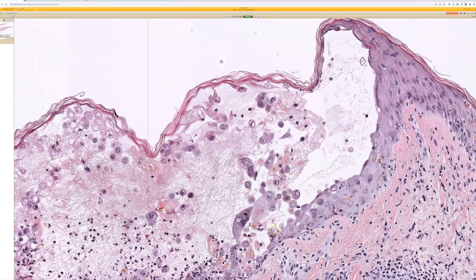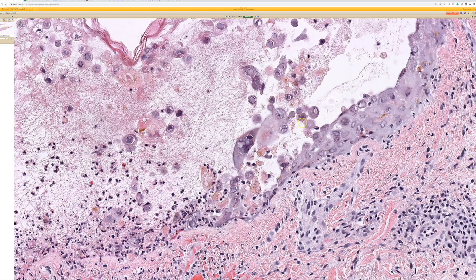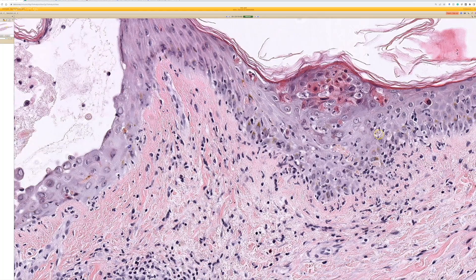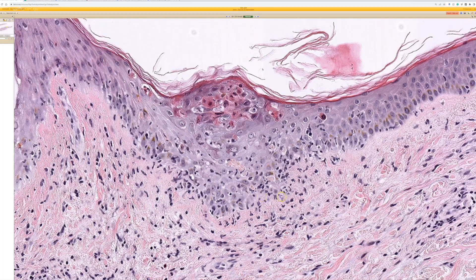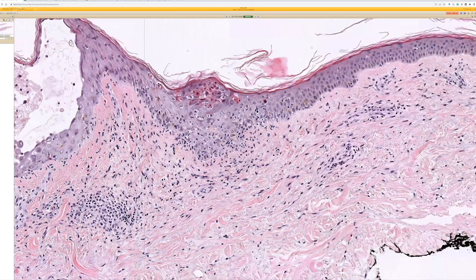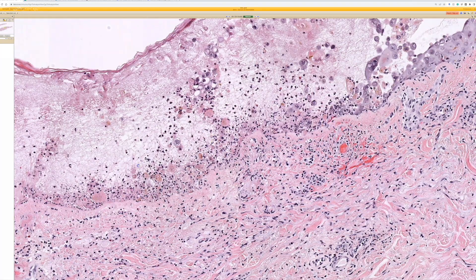I find oftentimes the edge, the periphery of the blister or the ulcer is where I'm more likely to find intact, viable keratinocytes with cytopathic HSV or VZV herpes cytopathic effect. Look — dying keratinocytes kind of mimicking a vacuolar interface here a little bit. Remember that you can sometimes have dying keratinocytes and interface change in herpes.